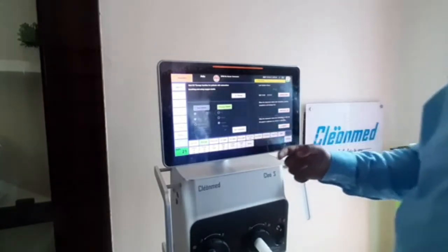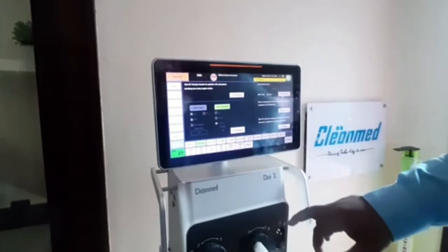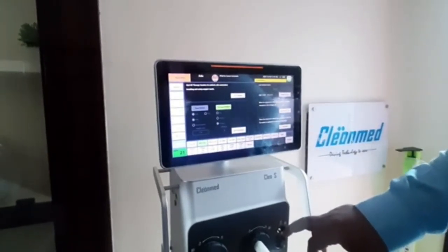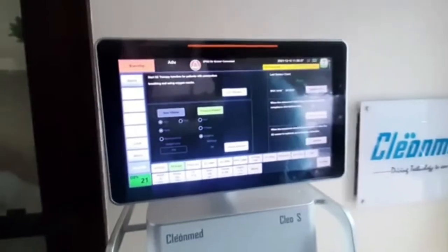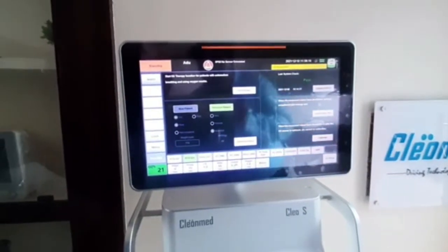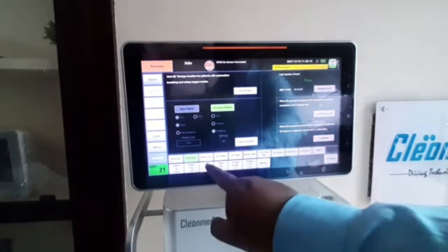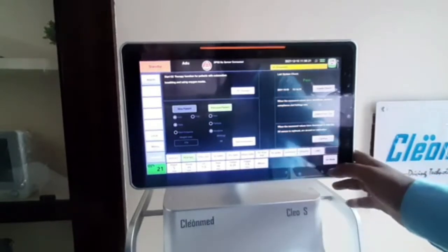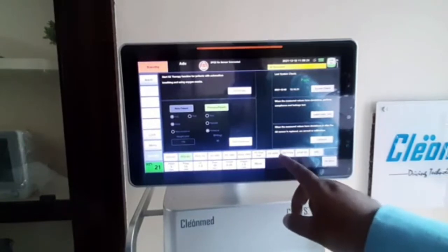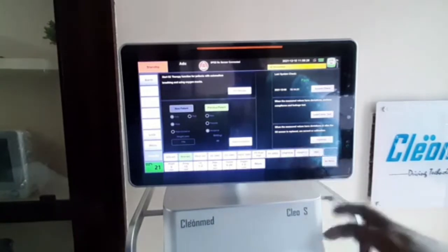During this O2 therapy, you can also see the time that is being utilized. Now, while selecting the ventilation mode, the various modes are volume assist control, pressure assist control, PRVC, VC SIMV, pressure SIMV, PRVC SIMV, PC DuoPAP, PC APRV, CPAP PSV, and we also have volume guaranteed CPAP and AMV.